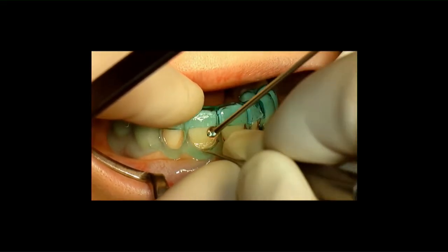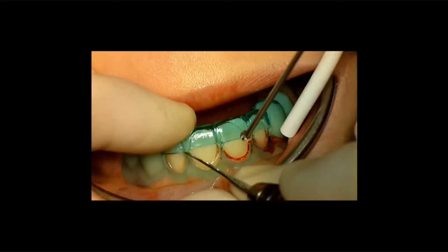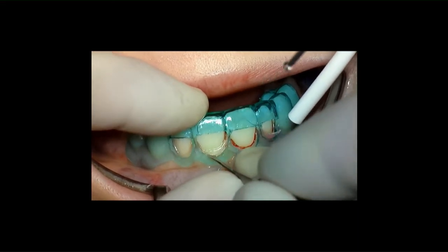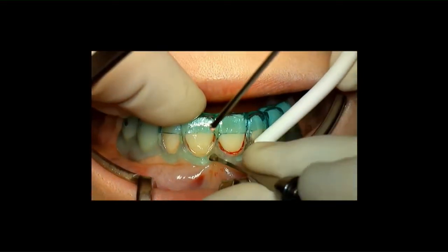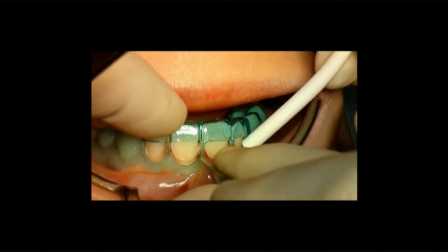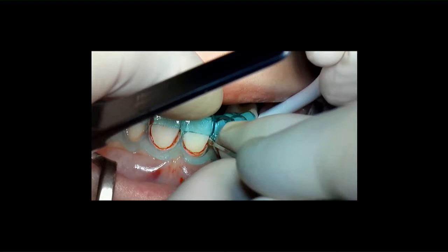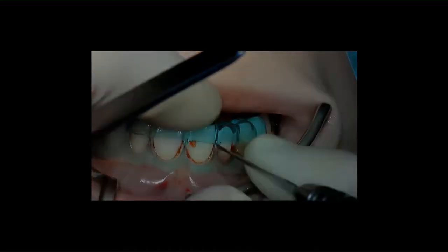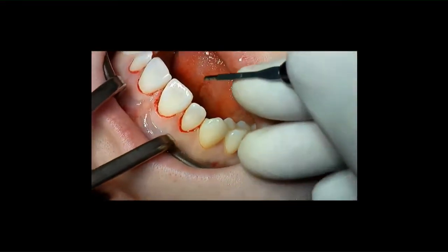I use loupe systems from Germany. It's called StarMed, and with these loupes, I have 6 times magnification, and they also have a camera that is connected to the loupes, and all my movies are recorded this way. So what you see is almost identical to what I see during surgery, and especially if you want to do surgical movies in the posterior part of your patients, this camera system is really great. StarMed is the company, and the camera is called StarCam.